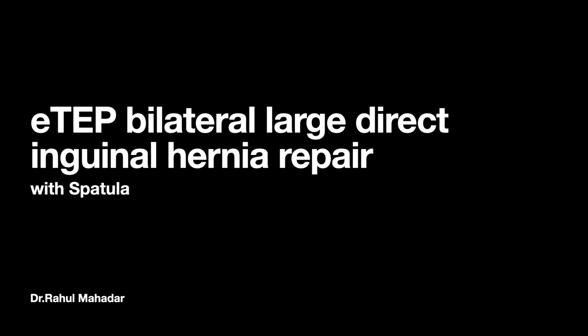Hello friends, today we are going to present the case of eTEP bilateral large direct inguinal hernia repair with minimum instrumentation, using only a spatula.